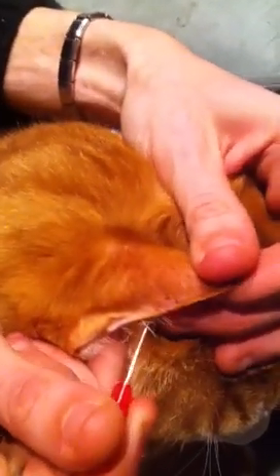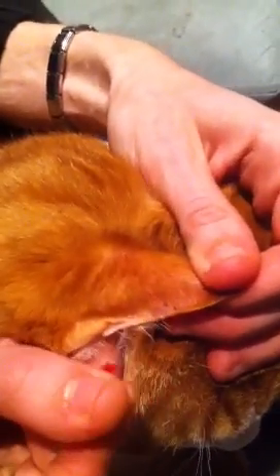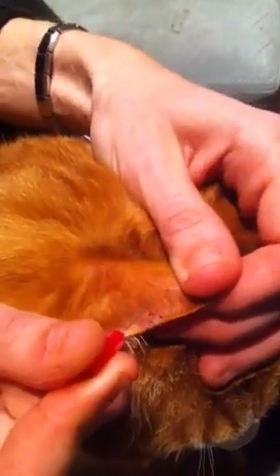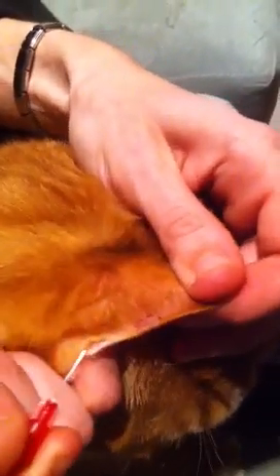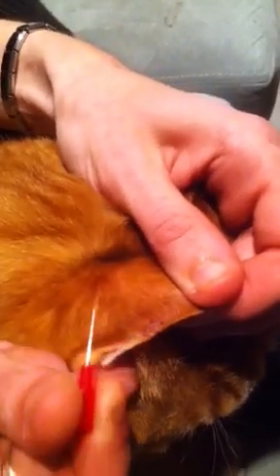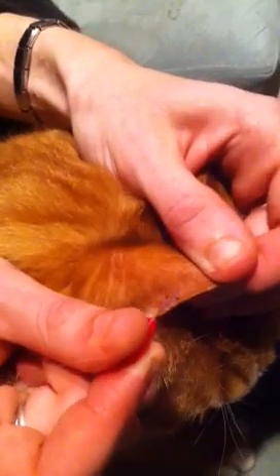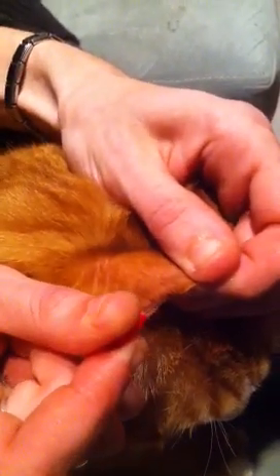It's just a little bit in. You want to try not to poke all the way through the ear, because then you'll have a drop on both sides. Basically, you're going to pull the ear nice and taut, hold the needle between your thumb and forefinger, and just poke.